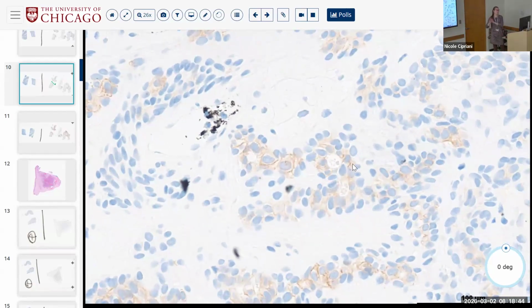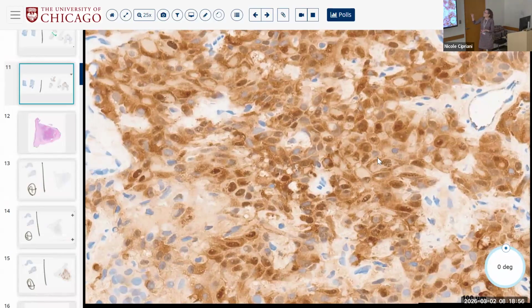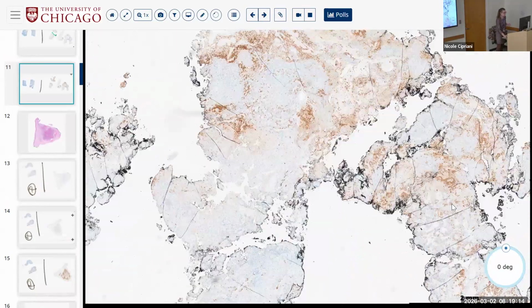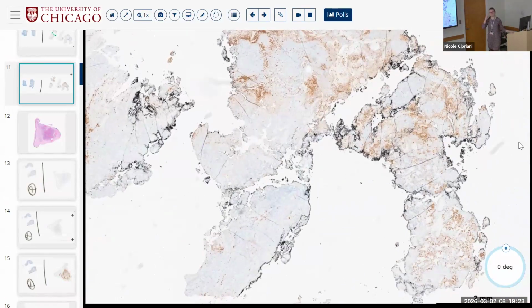So we have biphasic ducts, and then we have this sea of plasmacytoid myoepithelial cells that is usually strongly positive for our lovely third marker, which is S100. So the hyalinizing plasmacytoid myoepithelial cells in this tumor are S100 positive and usually P40 negative. However, the myoepithelial cells that are surrounding those bilayered ducts are the ones that are P40 positive. And so this is the geographic distribution that we like to characterize in these biphasic tumors, okay? So what are we narrowed down to now? What are we favoring of our biphasic?